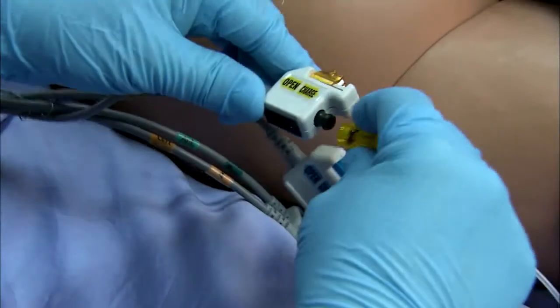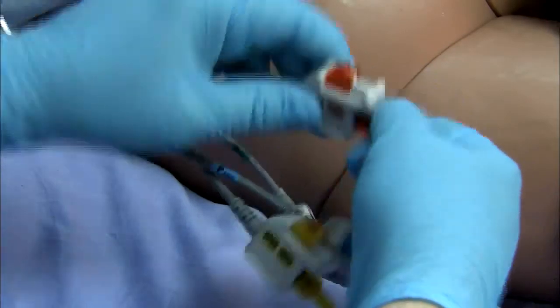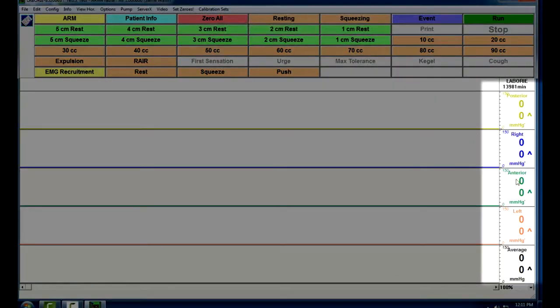With the transducers in the open position, attach the connectors from the arm catheter to the appropriately colored transducer. The connections must be tight. You want to make sure that the transducers are in the open position. This is very critical. They must be in the open position when you click the zero all button. The only time you should click the zero all button is when the transducers are in the open position. By doing so, it zeroes or balances out your transducers to atmospheric pressure. So they must be in the open position so that they're open to air. As you can see on the right hand side here, all our transducers are now at zero.